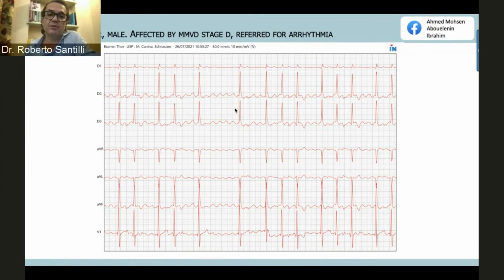So what's the problem? We use a drug because we want class 3, but we are also getting class 2, a beta blocking effect, and I really don't like to use a beta blocking effect if there is severe end stage congestive heart failure, just like in this case. So I'm a little bit worried about using a beta blocker at this stage, class D of the ACVIM consensus classification.